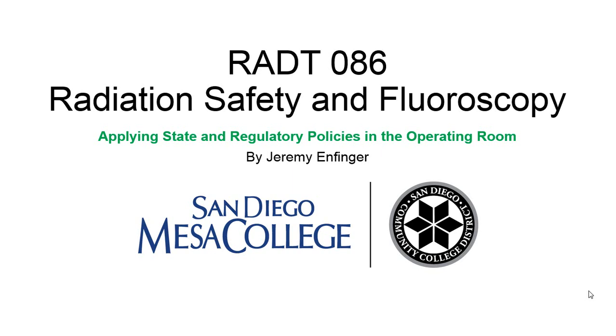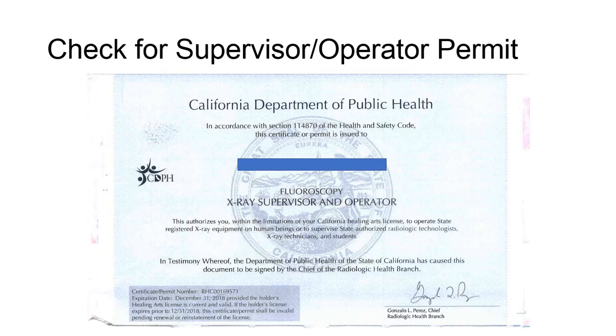Applying state and regulatory policies in the OR. When radiologic technologists enter the operating room to provide X-ray guidance for surgical procedures, there are many hats to be worn. In this presentation, I'll attempt to outline some basic responsibilities expected. You are the advocate for radiation protection in the operating room.